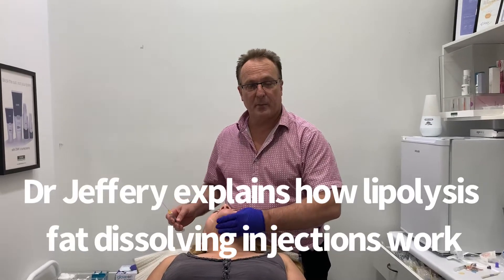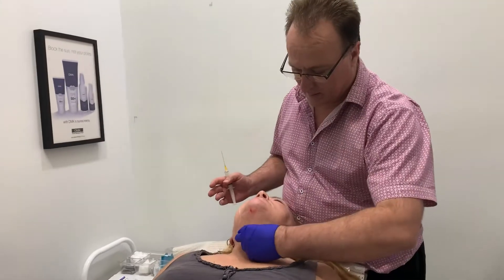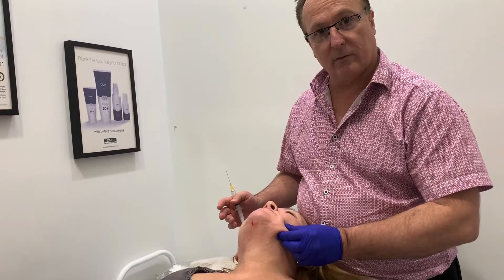Good afternoon, I'm Dr. Jeffrey. I'm here with a patient today and I'm going to be doing some lipolysis to tighten her submental area and we're going to deal with some of the jawline buccal fat tissue.